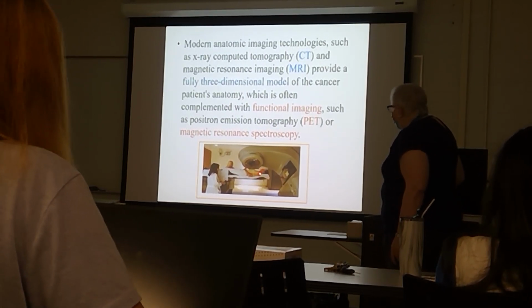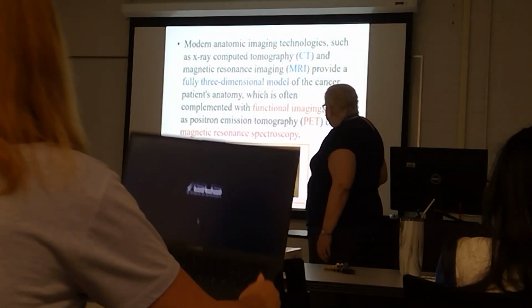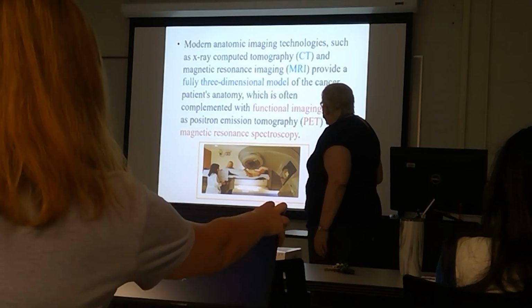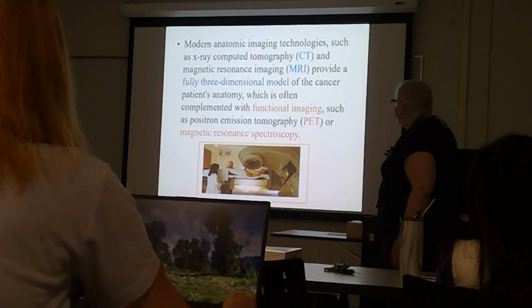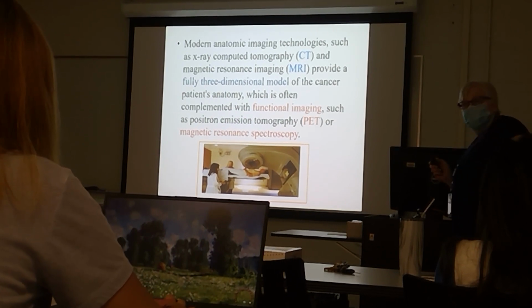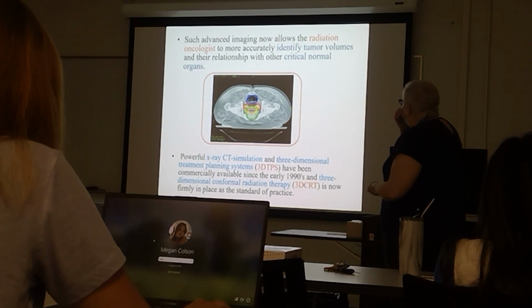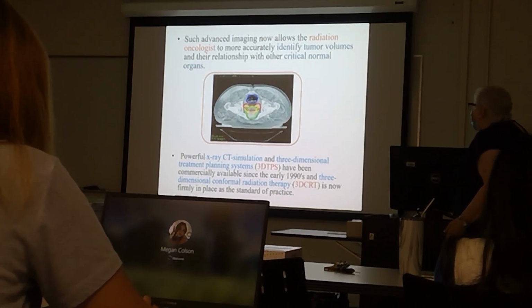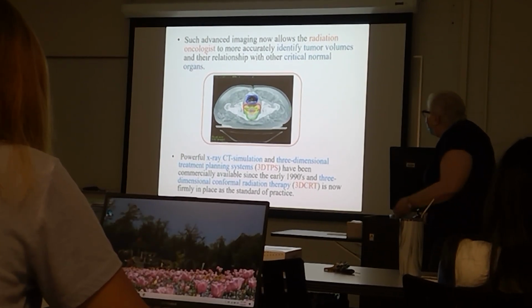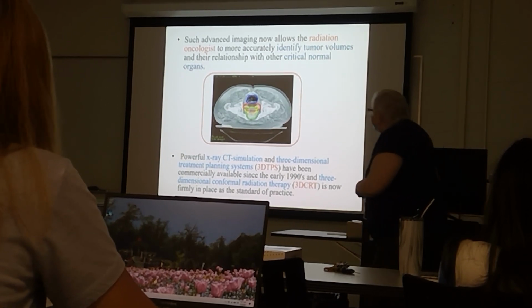It looks like a Clinac 600, which is a forerunner of the EX or the IX, whichever you want to say. So here is a CT slice. So you've got certain models here.